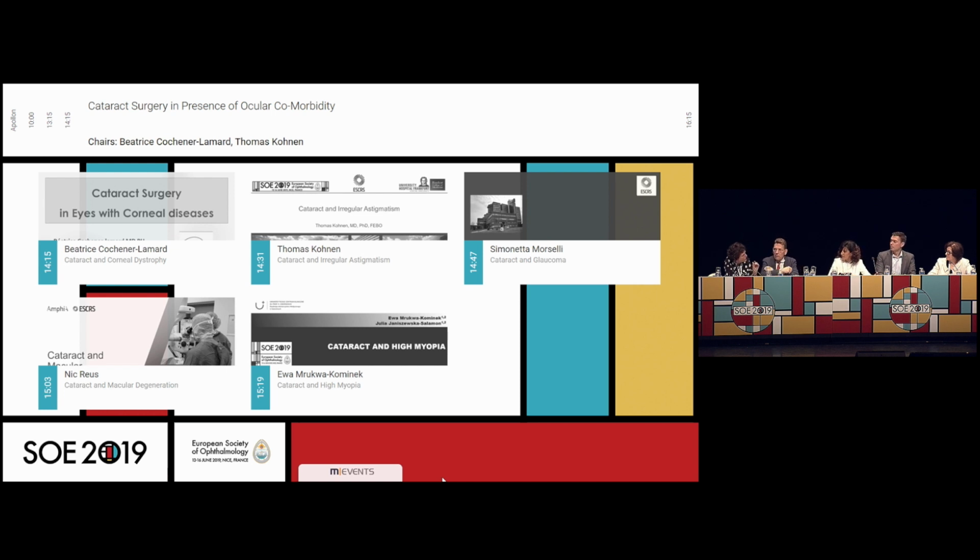There is a little trick on that. If you use your manipulator and keep it in the bag, just to slow down the intraocular pressure in the bag, that's very helpful to maintain it in a very regular way. So the second hand might be useful. Also the incision should be in the proper place, not too deep.